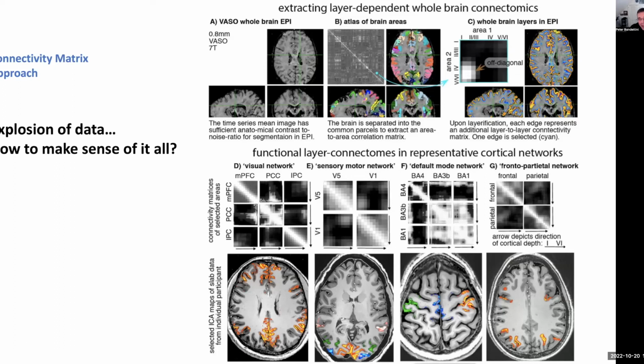So it's a real challenge to not only get robust, high sensitivity, high resolution images at this resolution, and to select just the vasculature that's sensitive to neural activity, but it's just hard to really make sense of the data. It's computationally currently kind of intractable to do it completely.